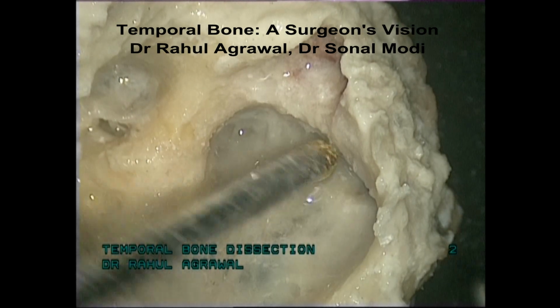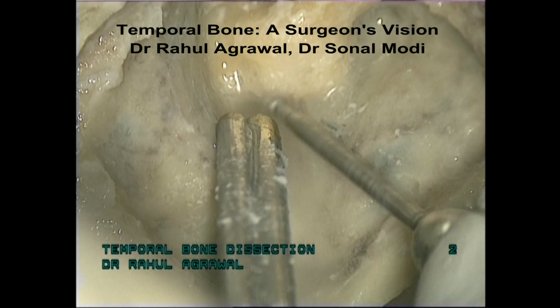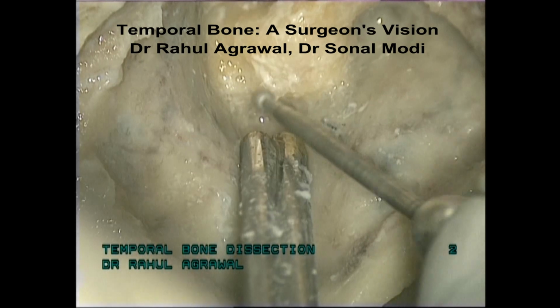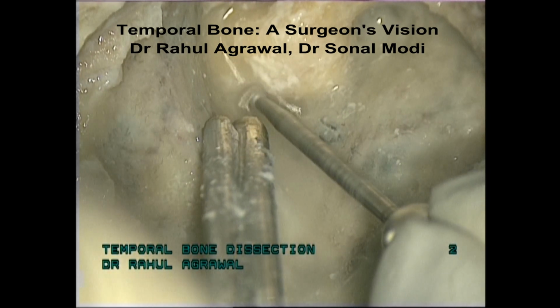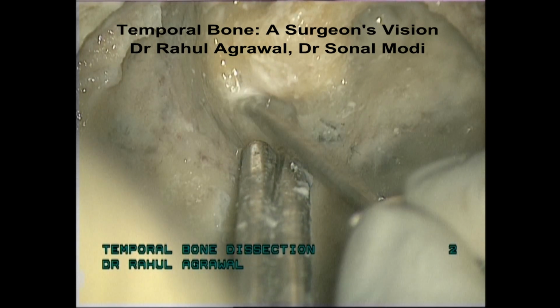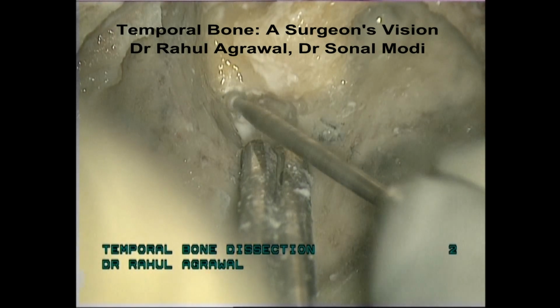You should be drilling in a low magnification so that you have better anatomical orientation, as you will be able to see more surrounding structures. But whenever in doubt, or from time to time while drilling, go under high magnification, observe the structure, come back to a low magnification and drill.